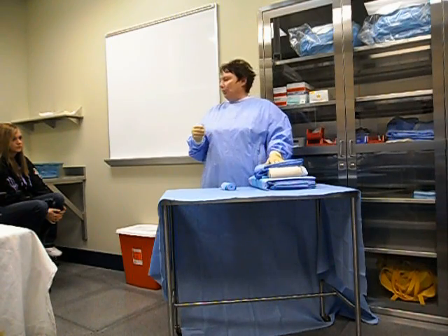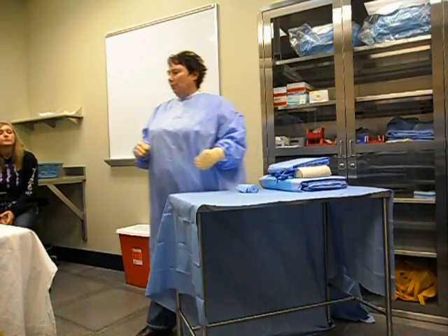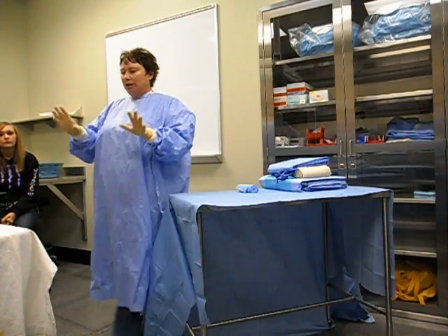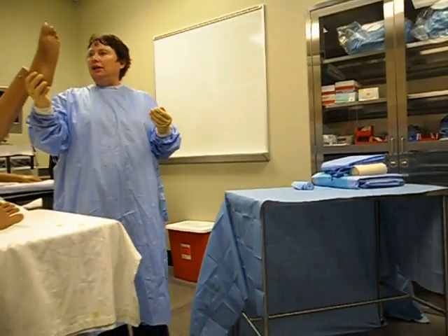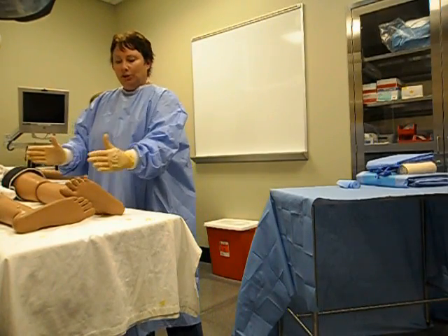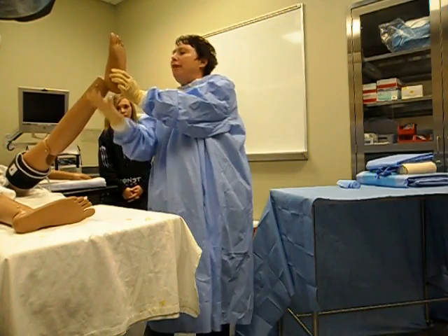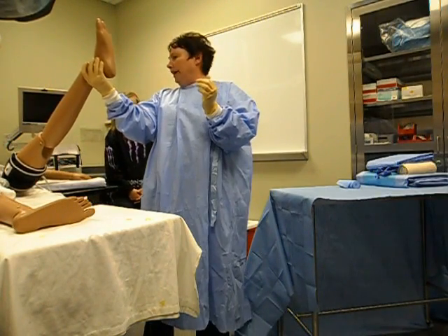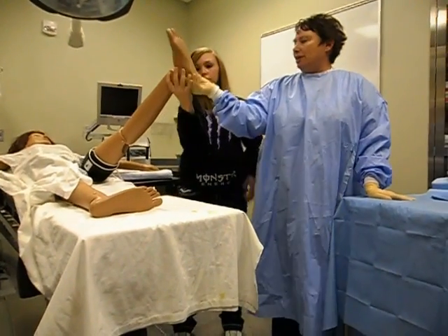In this scenario, I'm going to have Randy — since you're sitting there — and we'll pretend that I'm not sterile now. This patient would have their foot probably hanging from a candy cane stirrup, and Randy would have prepped the knee all the way down from the ankle to here. We'll pretend you took the candy cane stirrup off, and you're going to hold the leg as an unsterile person — a circulator — just like this.